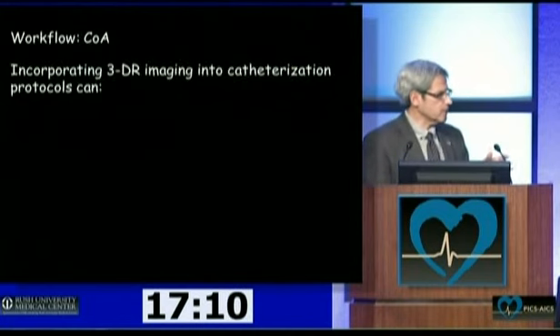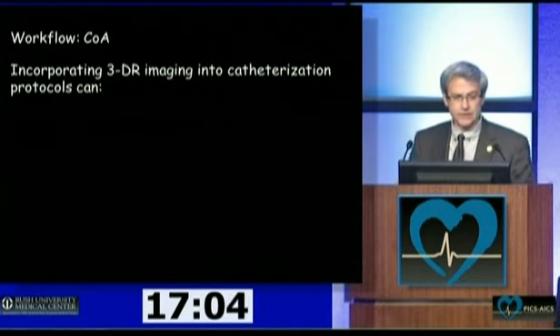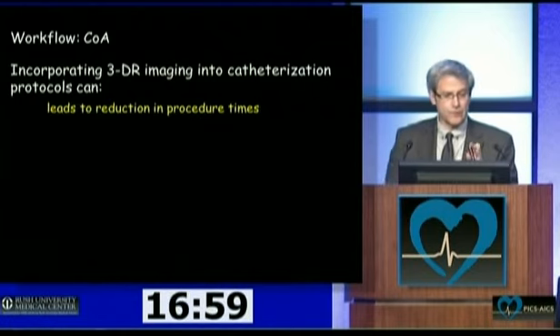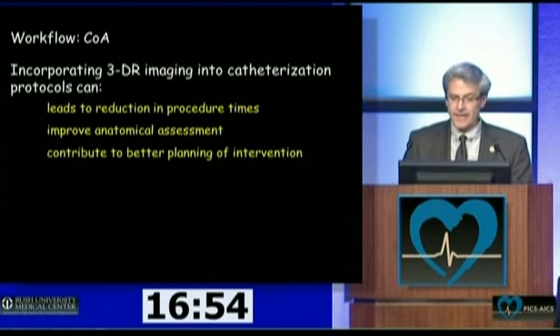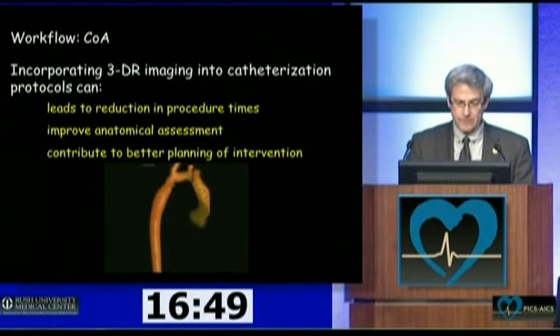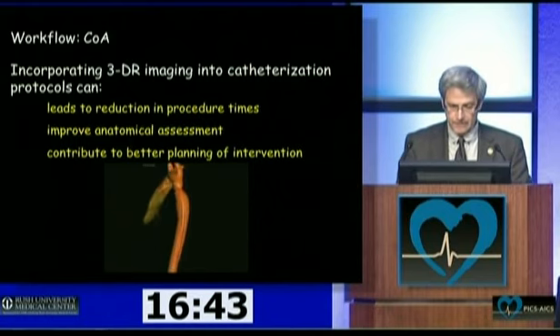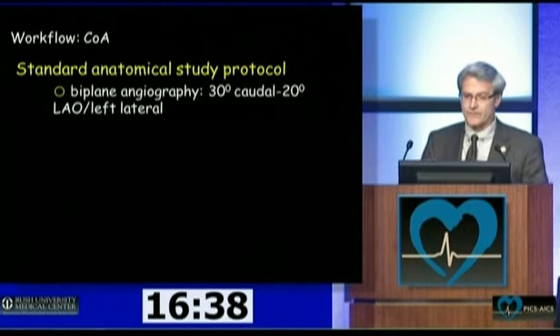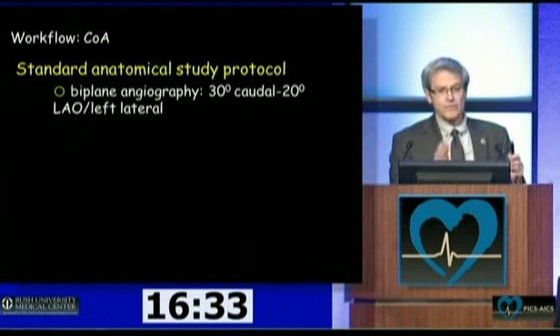So the first thing we wanted to talk about is workflow, and we've incorporated three-dimensional acquisition in the catheter lab with a focus to reduce the procedure time, to improve the anatomic assessment, and contribute to better planning of the intervention. As I mentioned, I'm going to use coarctation of the aorta as a paradigm for that strategy. I think all of us do coarctation stenting differently. There's no single way to do it.